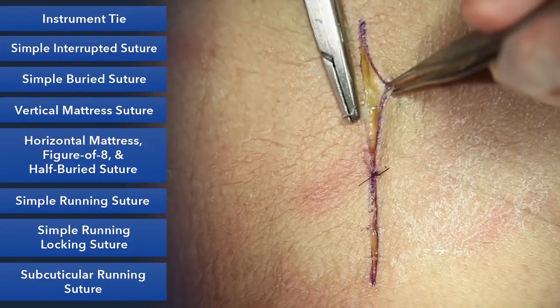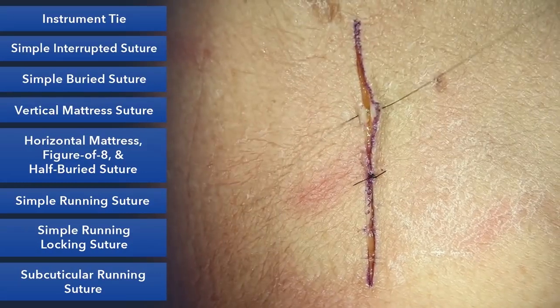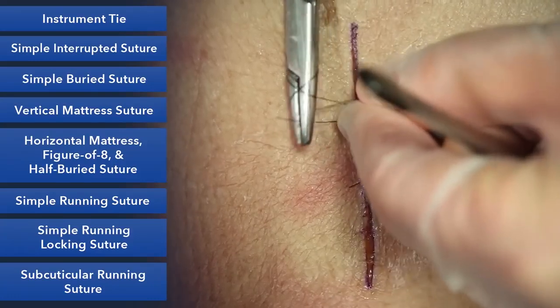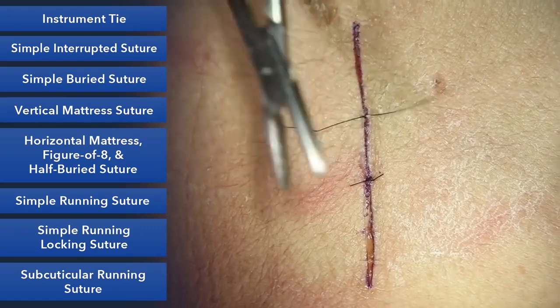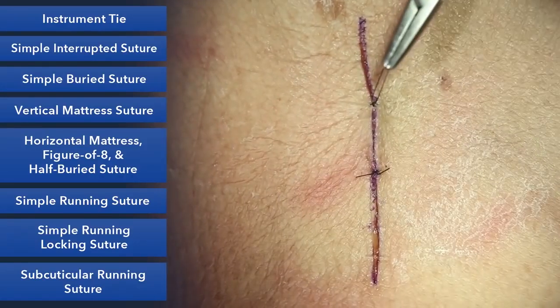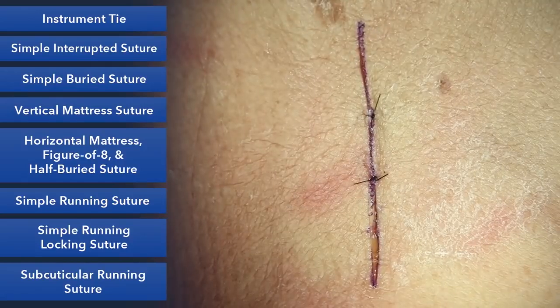Exaggerate at 90 degrees on each side and make sure you are back the same distance on each side. For the instrument tie, we do a surgeon's knot for the first throw — cross the suture over, lay it down nice and flat. Don't pull up on it until we get the second suture down, tighten it, and lock it in. This is the simple suture, and it's something that you'll need to practice a lot.